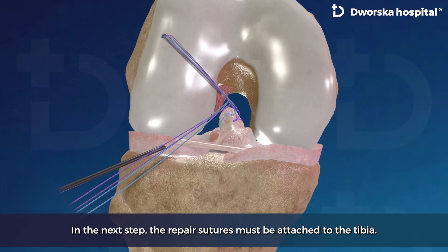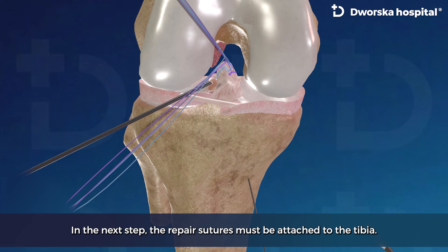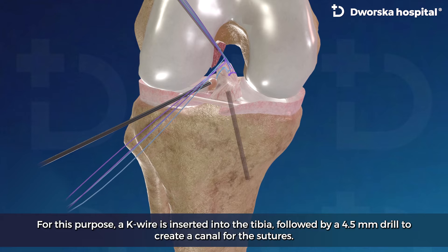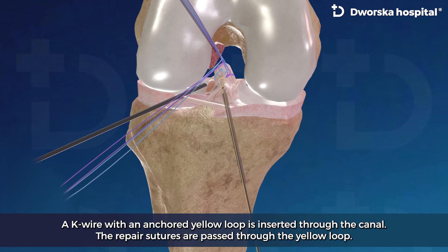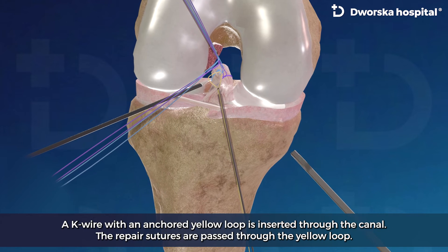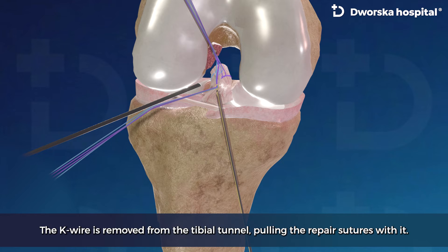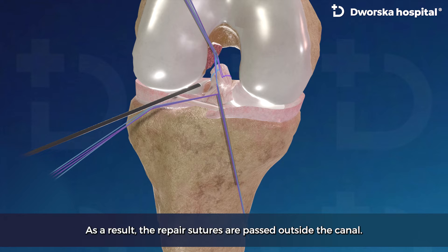In the next step, the repair sutures must be attached to the tibia. For this purpose, a K-wire is inserted into the tibia, followed by a 4.5 mm drill to create a canal for the sutures. A K-wire with an anchored yellow loop is inserted through the canal. The repair sutures are passed through the yellow loop. The K-wire is then removed from the tibial tunnel, pulling the repair sutures with it, so the repair sutures are passed outside the canal.